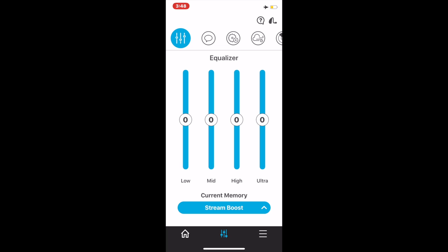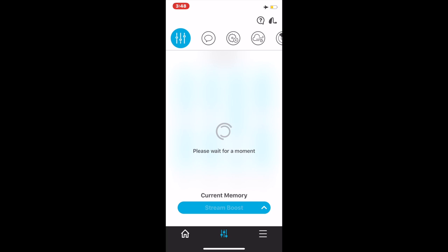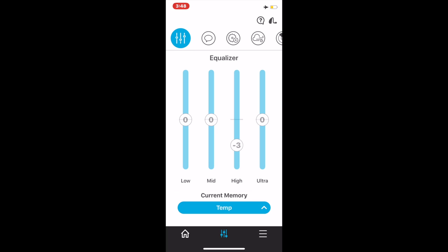So, you see there is low, mid, high, and ultra high. By adjusting these, it will adjust the sound quality of the devices while you keep it in this program.